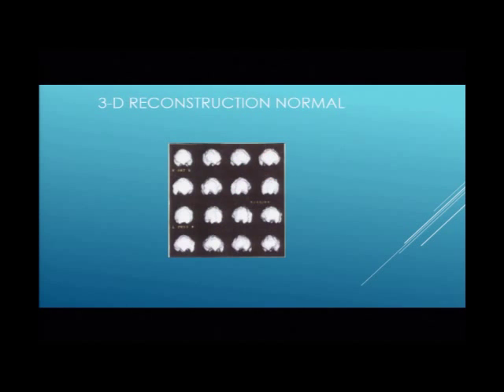So here's the 3D. The 3D, like I told you, shows you just the surface of the brain, and these are 16 views, and the brain rotates about 22.5 degrees each time, so you can see all the surfaces of the brain. This is the view head-on. It tells you anterior. This is right and this is left. And here are the frontal lobes, looking pretty white and pretty smooth and pretty regular. Down here, like earlobes, these are the temporal lobes. You can see that they're below the frontal lobe, and they're very round and very oval.